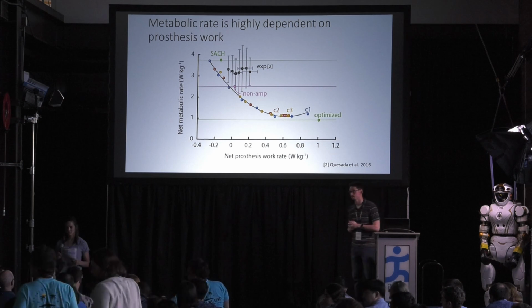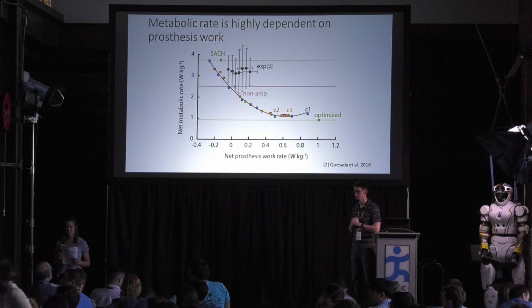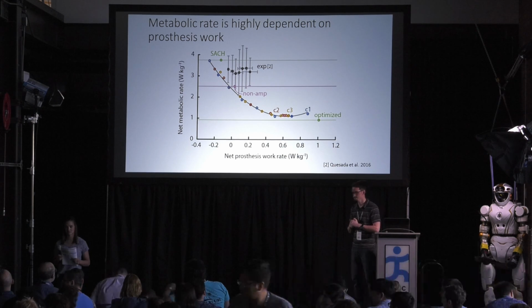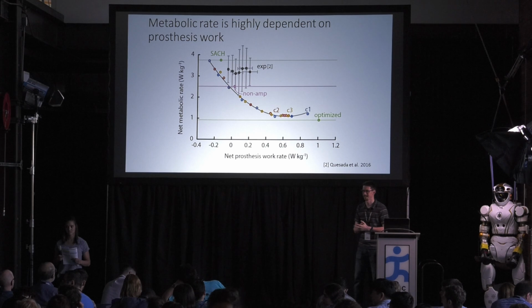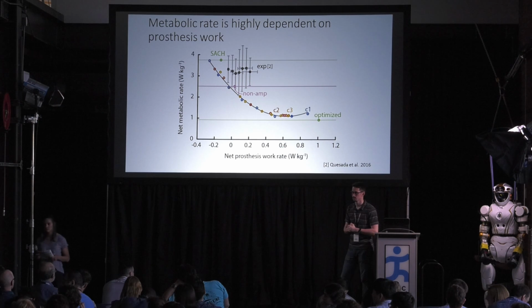So you made note of the fact that your current simulations suggest that prosthesis users are going to spend more time on their affected side, which is highly unlikely. Do you think you could talk about the expected effect of putting in something like a confidence term in that prosthesis?